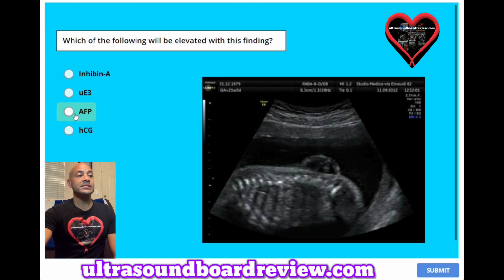The answer is C. AFP, and this ultrasound represents a fetus with spina bifida.